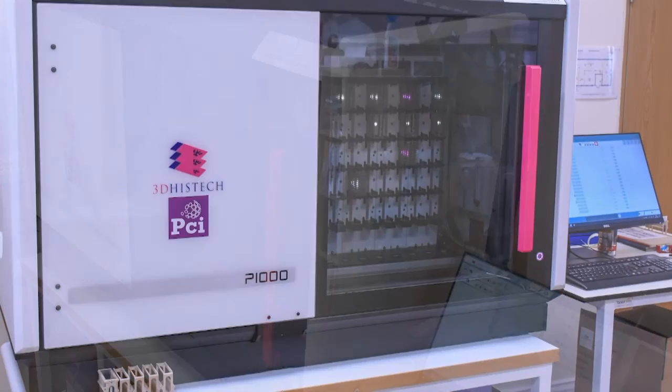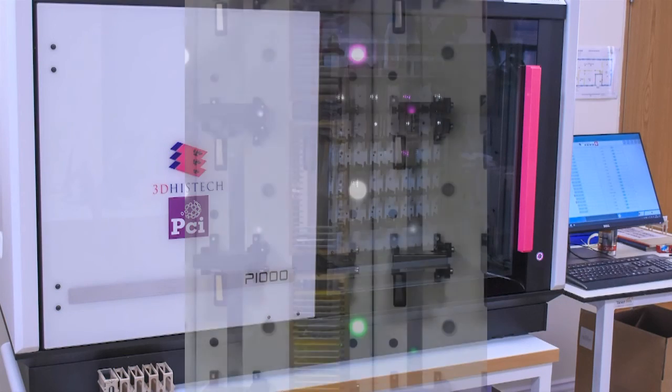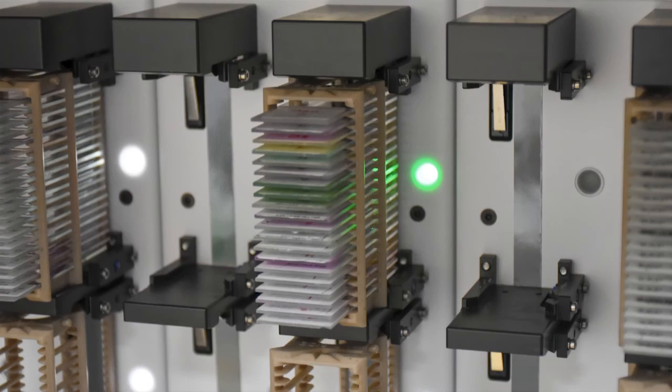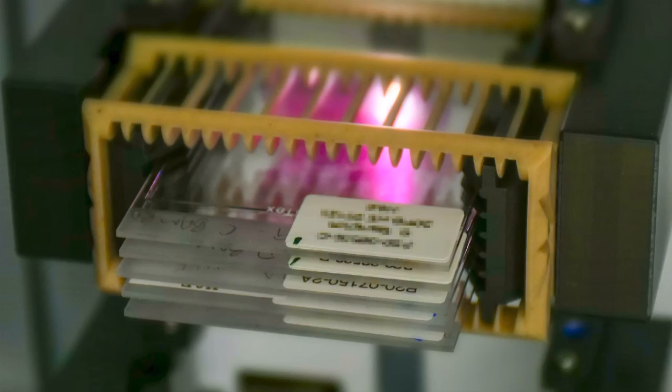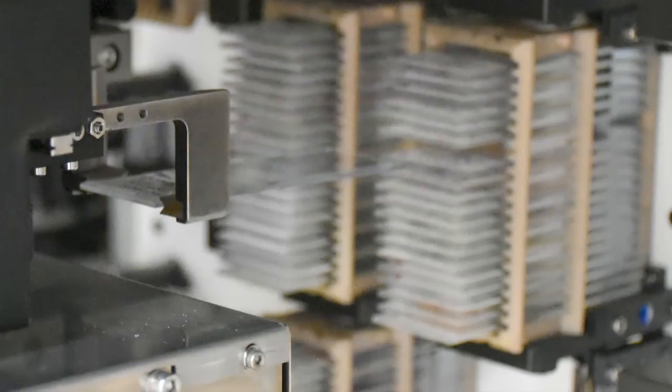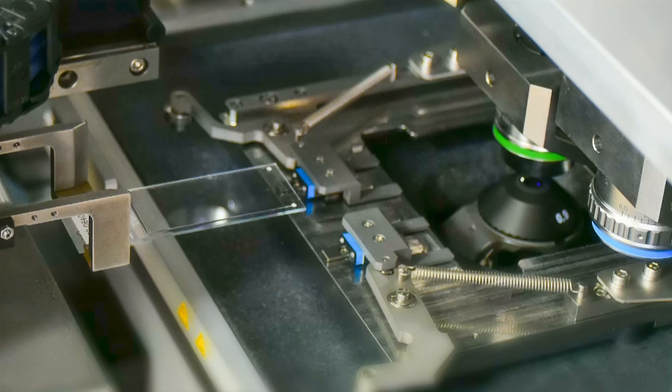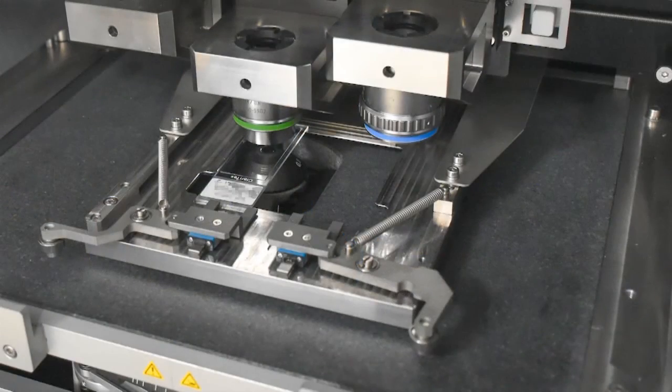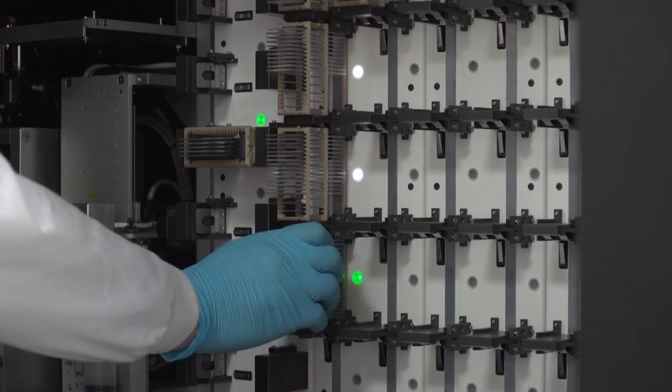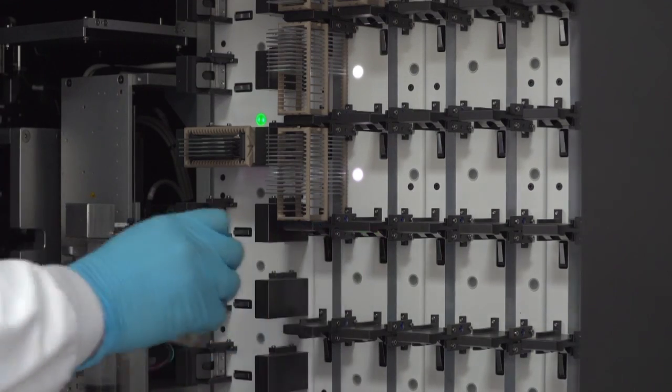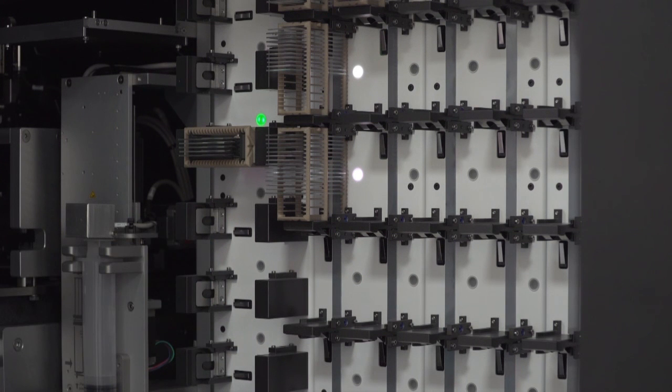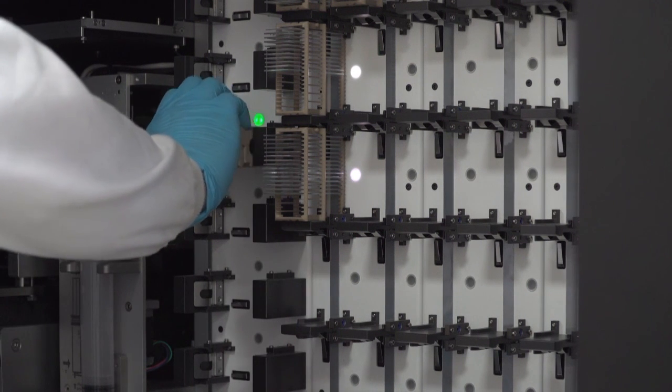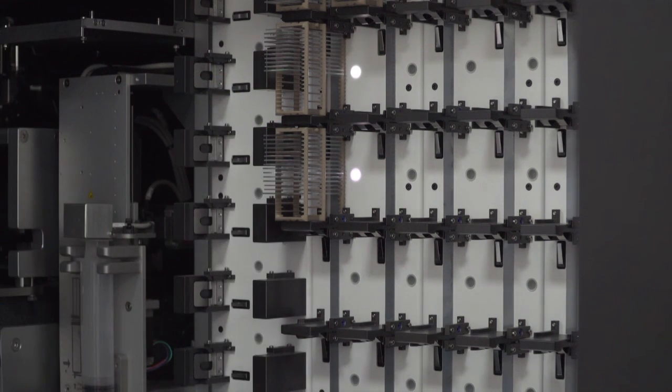Here are some still images of the system, showing you some more of the detail. And when the slides or the scanning has finished, they will turn green, and all of the racks that are green can be removed, as they have all been scanned.